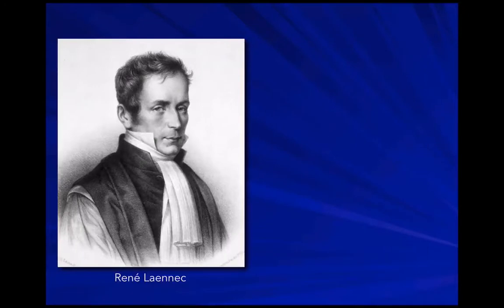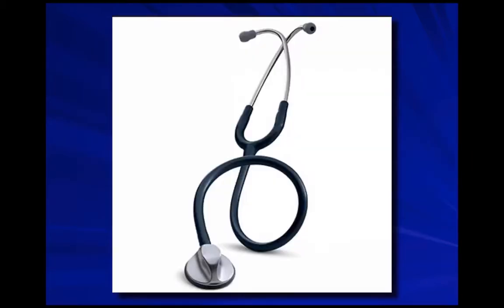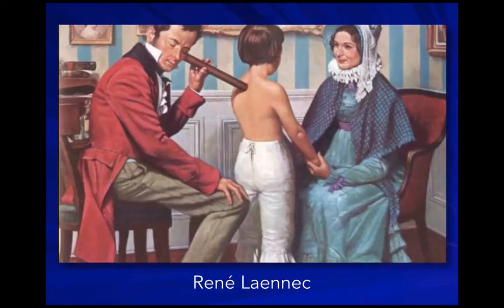And we'll start to talk about this gentleman, René Laennec. He's famous for this invention in 1816. So for about 200 years now, we've used variations of the stethoscope. Everybody thought that he was crazy initially, but I guess he wasn't. So here's a painting of Mr. René Laennec listening over the back of this patient, auscultating the lungs.